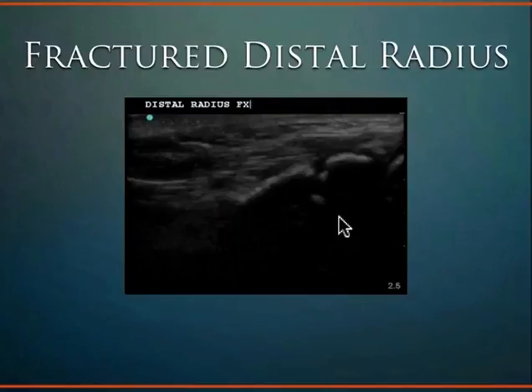So when you're doing an ultrasound, you put so much gel on it. You can get gel out of the refrigerator. I always keep the bottle in the refrigerator. And so you can put some chilled gel on there, and then you don't even touch the skin. The ultrasound touches the gel, and then it's actually painless to do an ultrasound for a fracture, as long as you're not moving the bones. Once you start moving the bones around, then the patient will let you know about it. For sure.